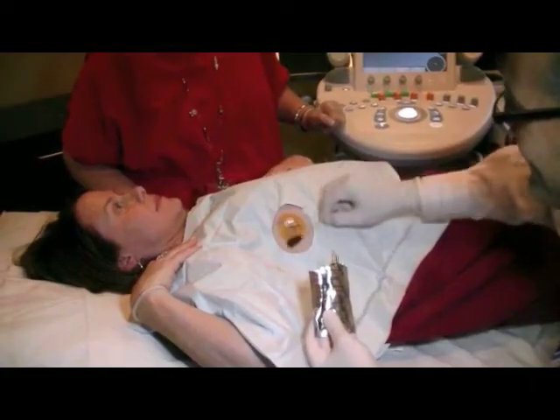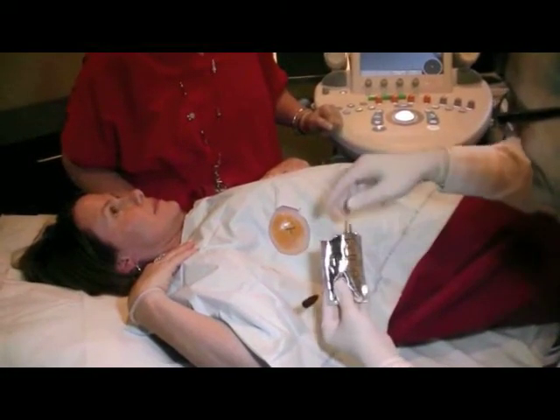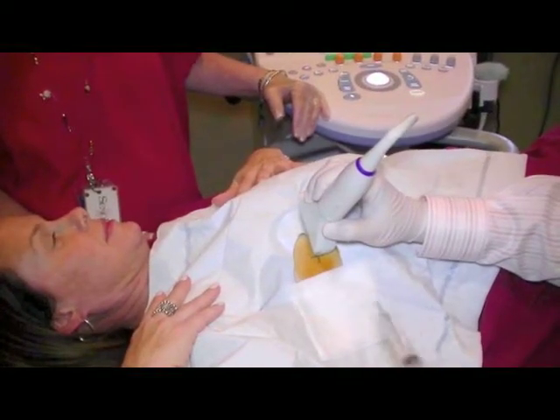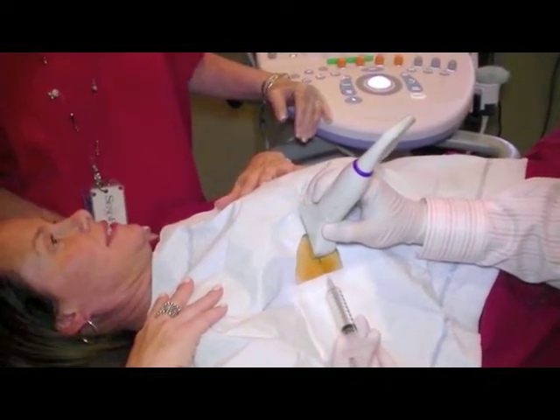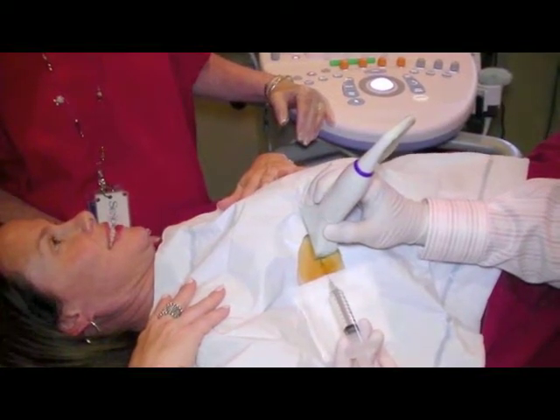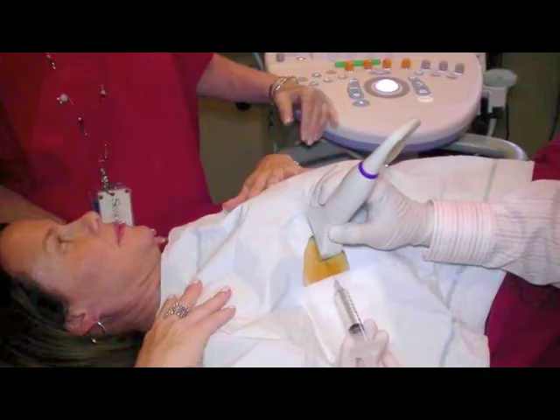The breast skin surface is then cleansed with betadine, a brown-colored soap solution. Lidocaine, a medicine used for anesthesia, is then injected into the breast tissues in the region of the lesion to prevent or minimize any discomfort during the biopsy procedure using a small and very thin needle. Please let us know if you have any medication allergies.